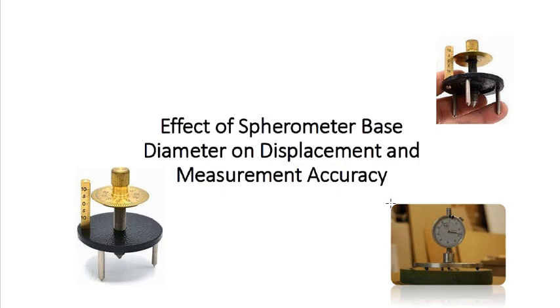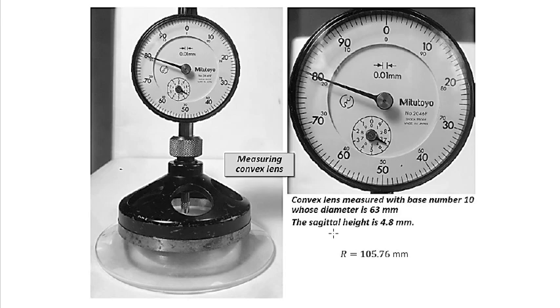Now we're going to get into a little bit on the effect of your spherometer base diameter on displacement and your measurement accuracy. This is a vintage one. We now use a dial gauge and a base setup, and this is our result.